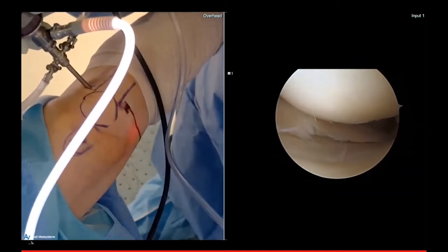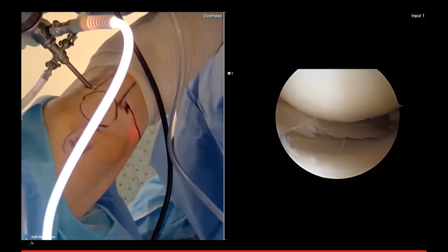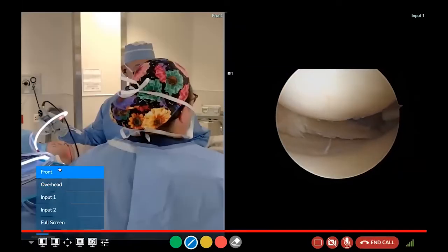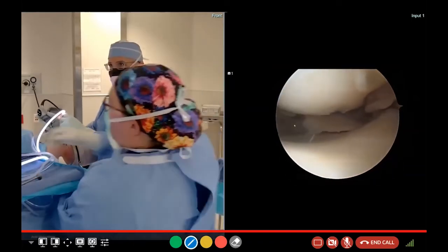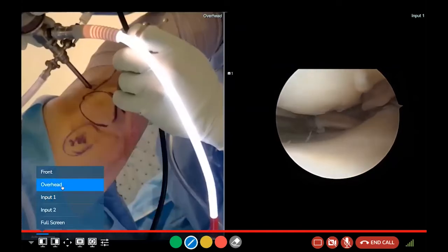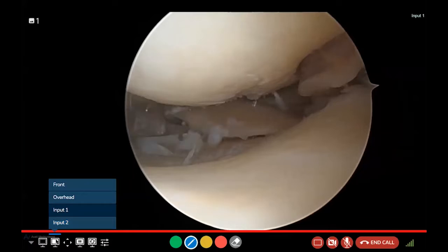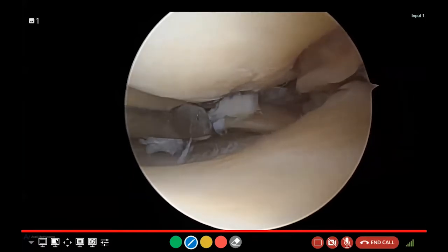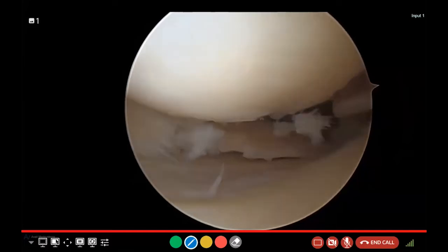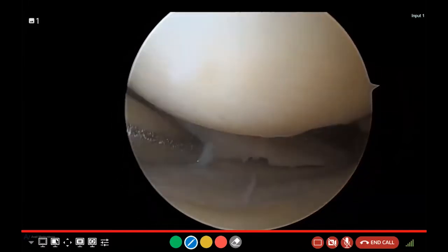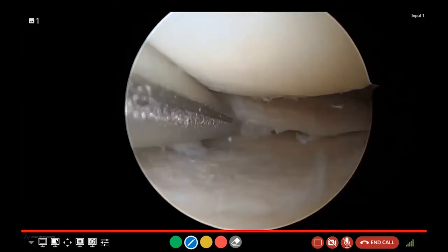Let's have the oyster biter. What we do is remove the torn part of the meniscus. There are a lot of different instruments that we use. This is just a straight biter — it is exactly what you think. All I'm doing is biting away the torn part of the meniscus. You hear people talk about having a meniscus repaired — certainly in some clinical situations we repair the meniscus, but when there's arthritis change or the patient is older, we tend to just remove the torn part. People at church say they had their meniscus repaired, but they probably just had it removed.